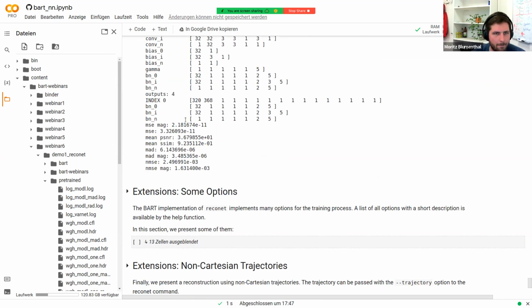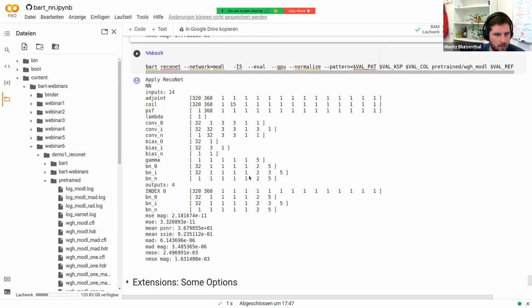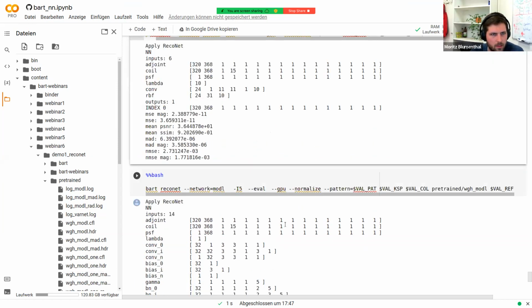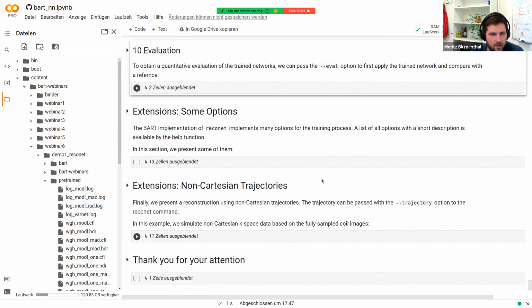Moritz, it's a lot of detail and it looks really great. We have a number of questions. Yes. So just before we answer them, it looks like you want to show some extensions, and then there's going to be another demo after. Is that right? So why don't you just talk about the extensions, and then we can take questions and take a quick break.